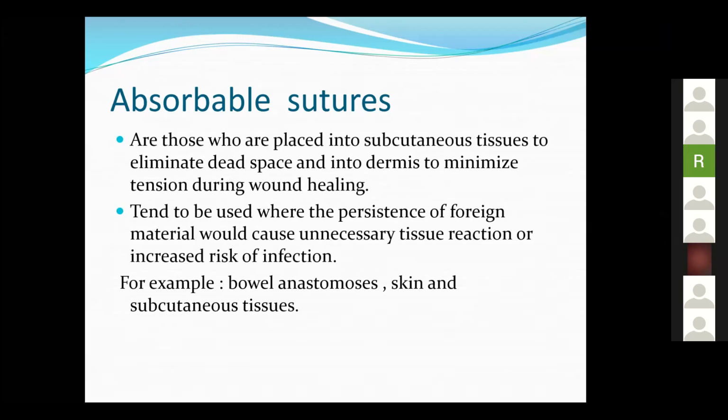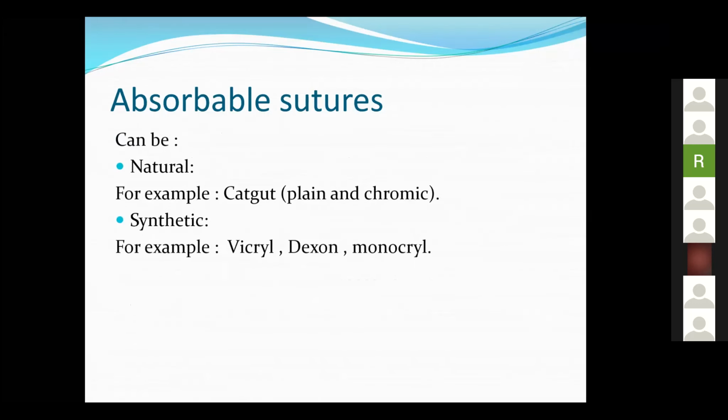We use absorbable sutures like in bowel anastomosis. Maybe we apply them on subcuticular skin where they get absorbed. We ligate the blood vessels with that. So how do we use different things accordingly? Generally, it is used for ligating blood vessels, bowel anastomosis, fascia anastomosis, especially smaller areas where we want to use it. And we use them for subcutaneous tissue and for skin subcuticular tissues.